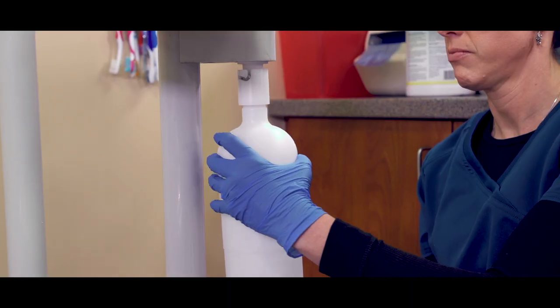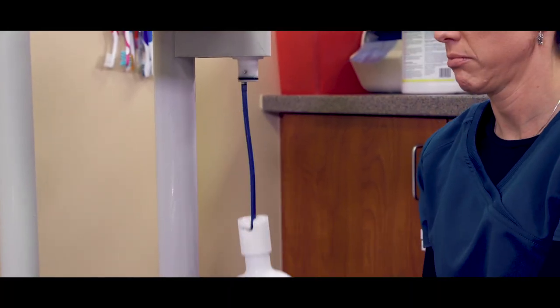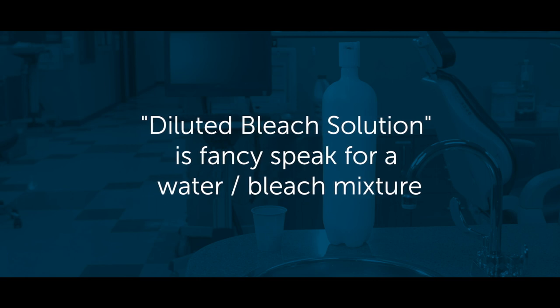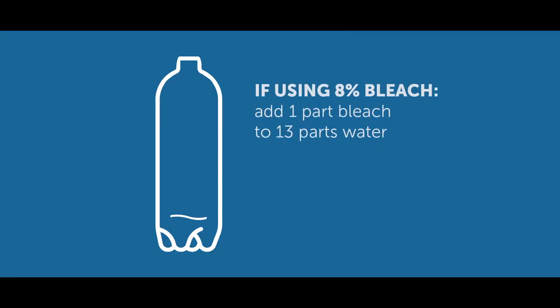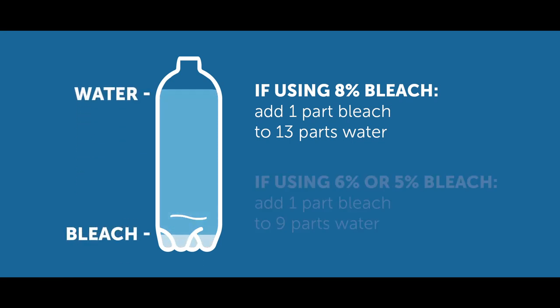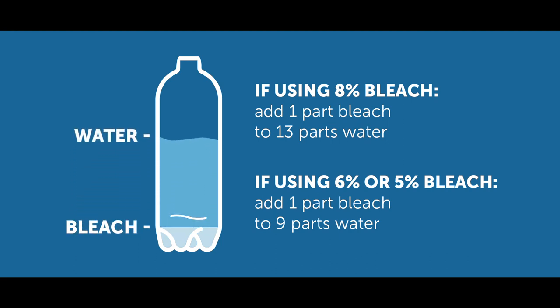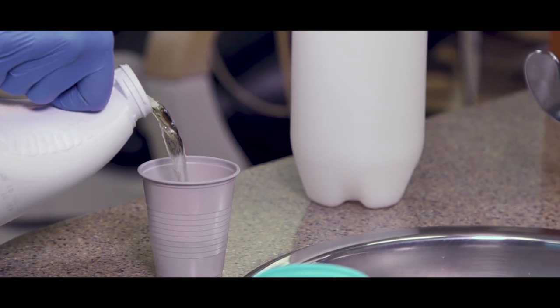First, remove the water bottle from your dental unit — we're going to create the diluted bleach solution in the water bottle. Quick check: check your bleach concentrate. Our product uses 8% bleach, but yours may be 6% or 5%. For 8%, add 1 part bleach to 13 parts water. For 6% or 5%, add 1 part bleach for every 9 parts water.